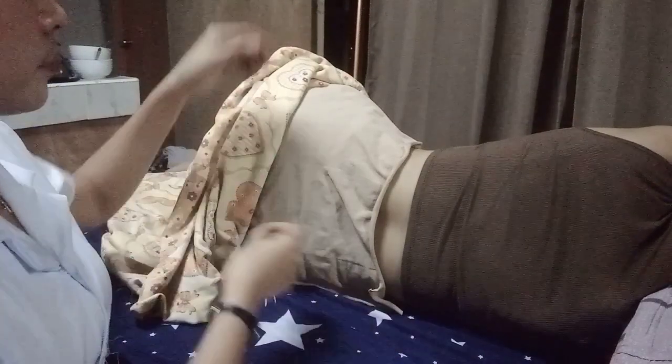Now, help the patient find a comfortable position that will accommodate the injection site you've chosen and expose only the portion of the body. Now, this is her position. And then after that, apply gloves and use anatomic landmarks to find the site again.